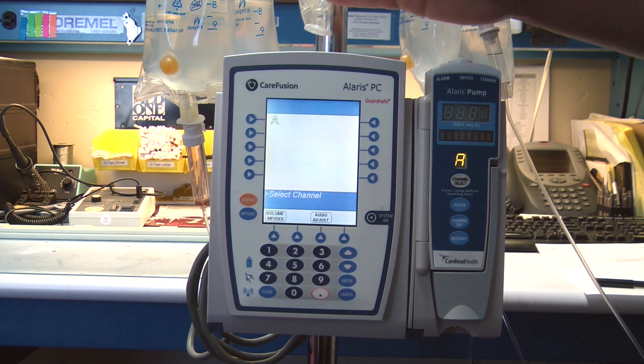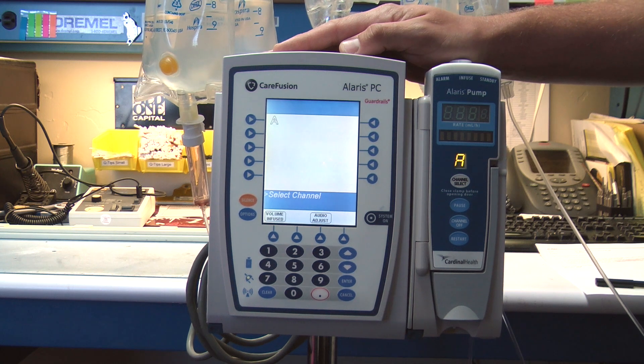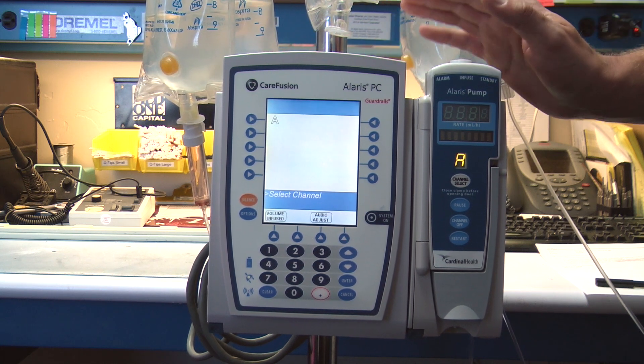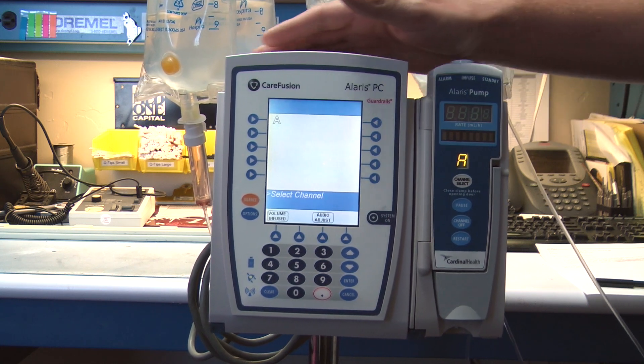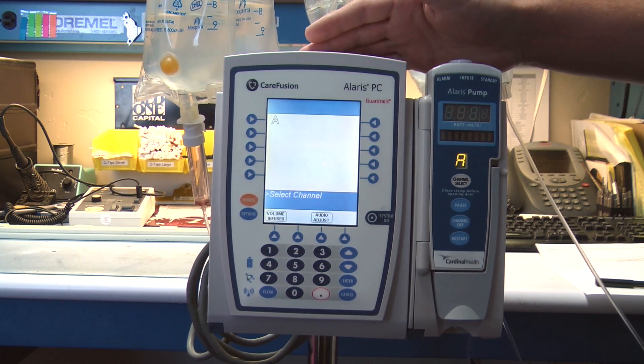This pump can be used to connect to your PCU models 8000 or 8015. With this pump, this is a great pump to be used in the hospital anywhere from your general care settings all the way up to ICU.